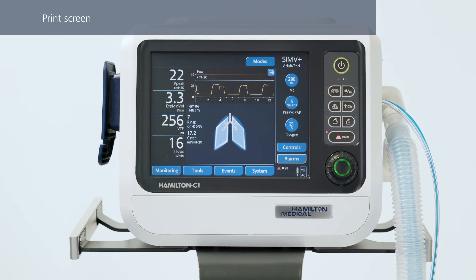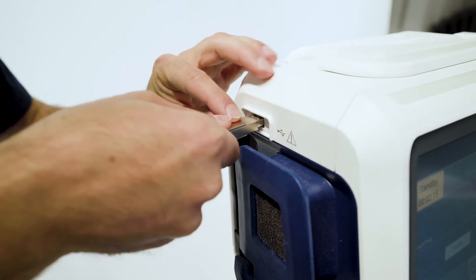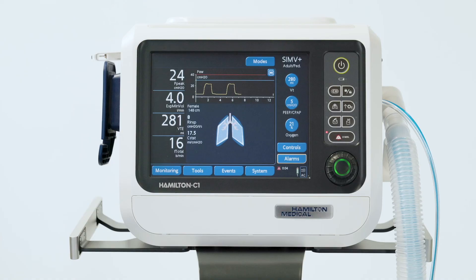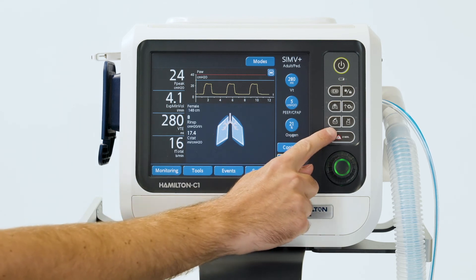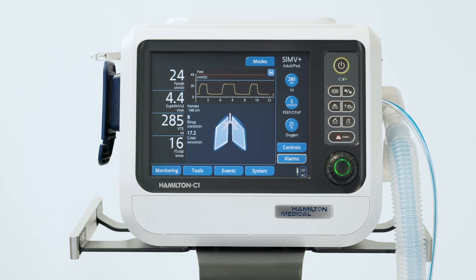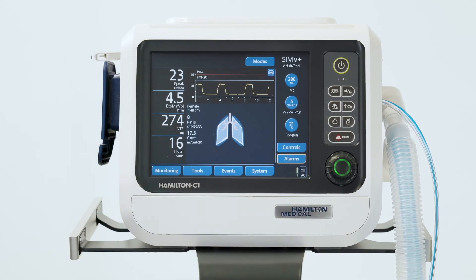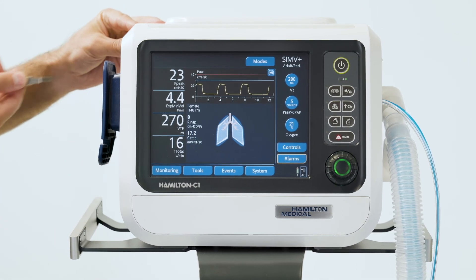Whenever you need to save the current ventilator screen, you can use the print screen function. Firstly, insert a USB stick. When the desired screen appears, just press the print screen key. A JPEG file of the current ventilation screen is saved to the screenshot folder on the USB stick. You'll see that the green indicator next to the key is lit while the device is saving the image. Wait until the green LED is off before removing the USB stick.